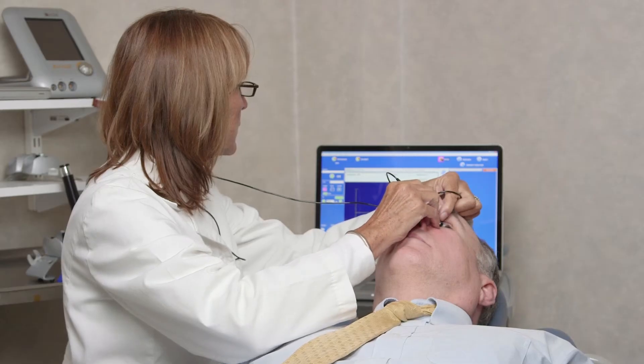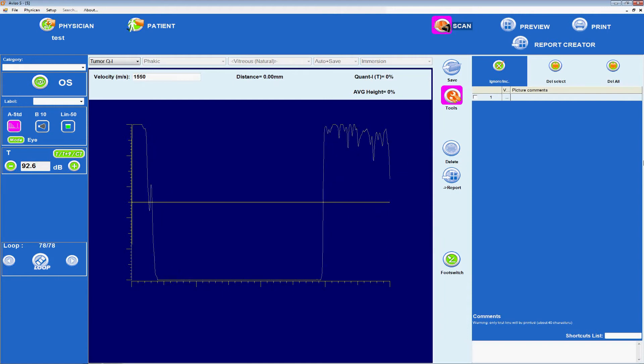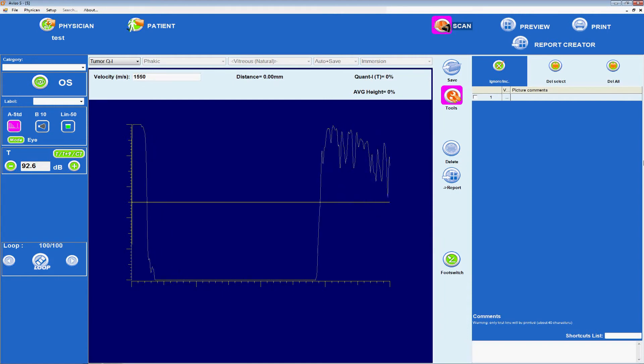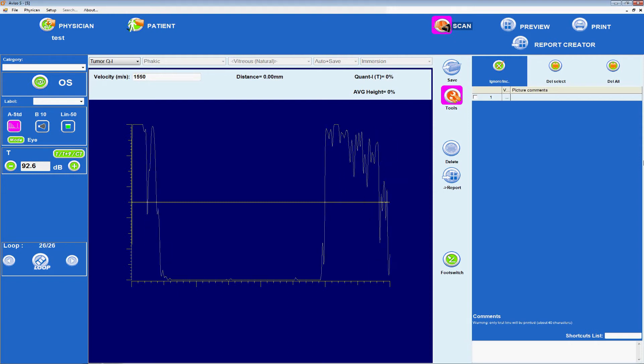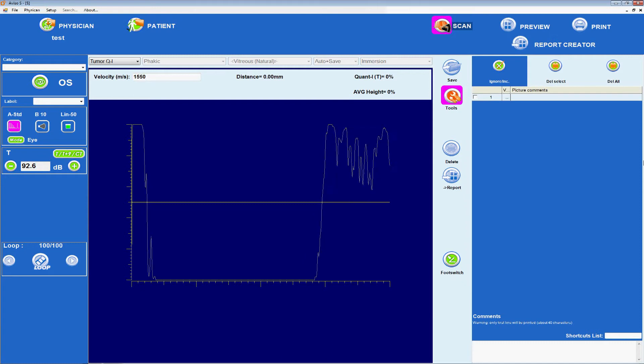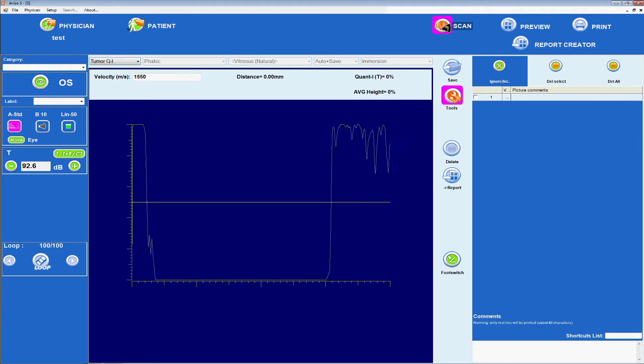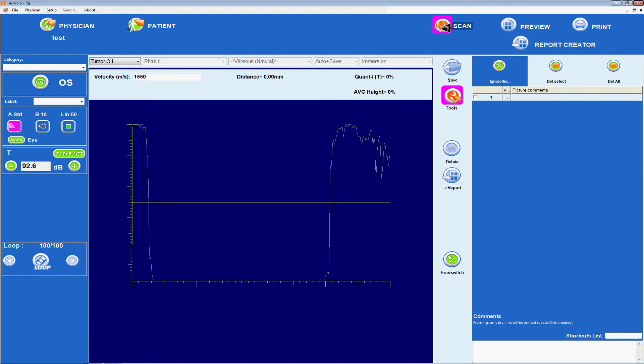Standardized A-scan, on the other hand, can provide richly detailed quantitative information that adds to the B-scan picture. As ultrasound energy moves from the A-scan probe into the eye, any structure it encounters will produce a reflection and an associated spike.